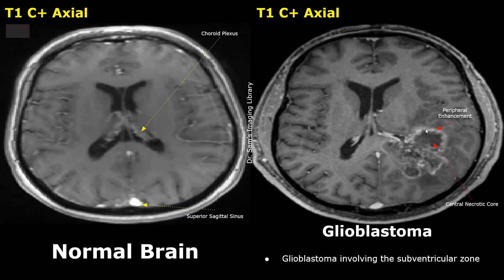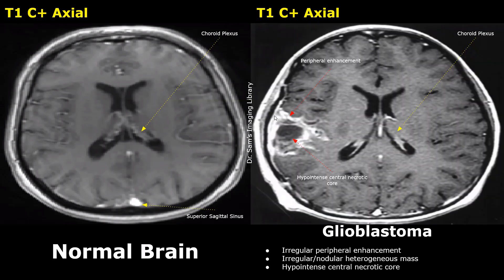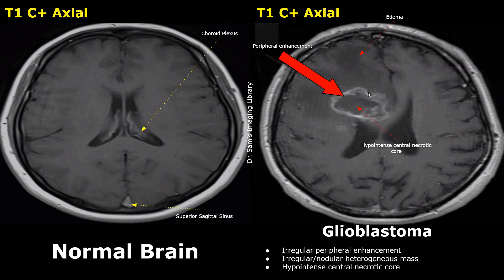Mild midline shift is also noted. In this case, the peripheral enhancement is very strong. The enhancement is irregular and surrounds a hypo-intense central necrotic core. The central core will not show enhancement because of cystic necrosis. Here is another T1 contrast enhanced image showing the typical features of glioblastoma: an irregularly shaped heterogeneous mass with peripheral enhancement and a hypo-intense central necrotic core.